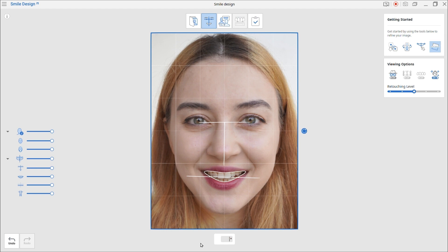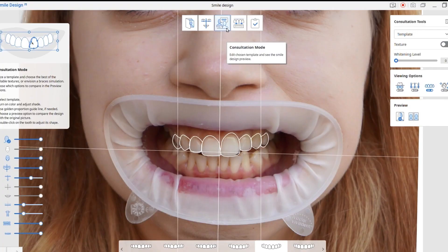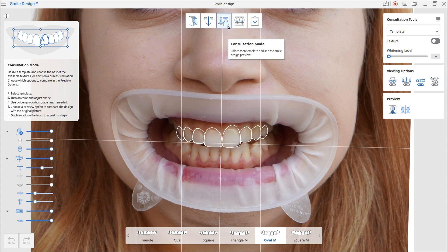If you've finished aligning the images using the tools provided, we will move on to the next stage: Consultation Mode. Plan your simulation using the variety of options provided, such as templates, braces, and teeth whitening. We will take a closer look at each option.